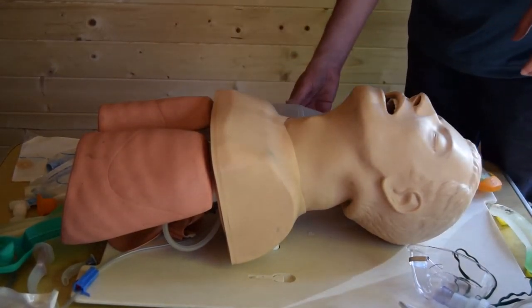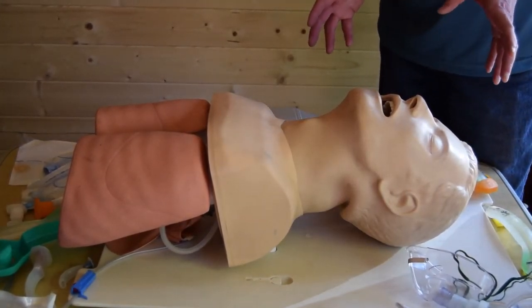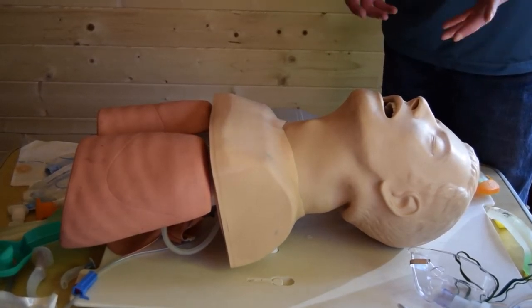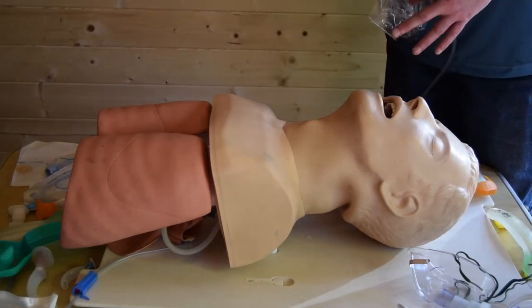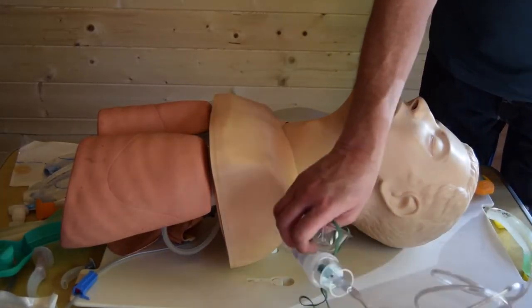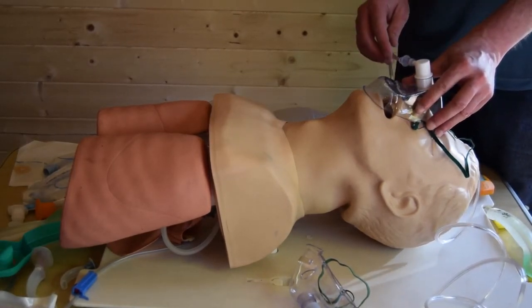Okay. So other considerations is about oxygenation. Any time you're performing any sort of airway manoeuvre with a patient, if it's unsuccessful or you have trouble getting that airway in, it's best to stop, re-oxygenate the patient and then carry on. So we might re-oxygenate using a bag valve and mask attached to high flow oxygen, or we might use some sort of oxygen mask, such as a simple mask or a non-rebreather mask, just to top up that patient's oxygen.